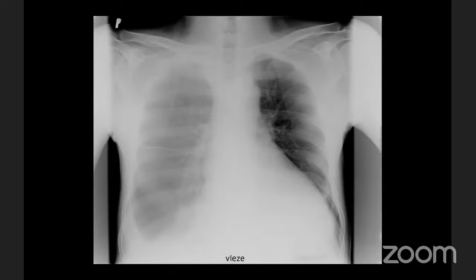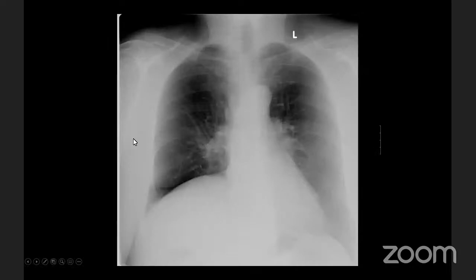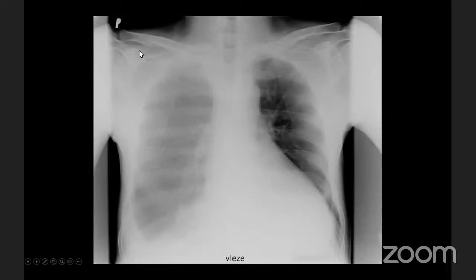Be careful about scapulas, and definitely in lying down patients. When you have a standing up patient, the scapulas are out of the lung fields, because standing patients are asked to move their shoulders forward. Lying patients usually have scapulas in the lung fields, which is one of the ways you can recognize the picture. So this is the scapula, and it can cause a lot of problems. Anytime you see a line, always follow it. Try to see it in the bigger picture, and this is just a scapula. Great question, thank you very much, because this is something I really would like for you to look for and be careful about.